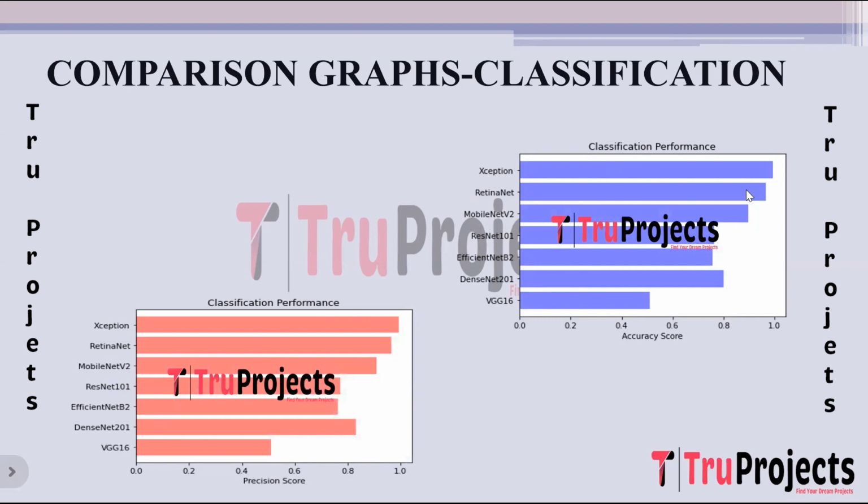This is the accuracy comparison graph. On the x-axis, we have accuracy score, and on the y-axis, we have algorithm name. Accuracy is a measure of the overall correctness of a classification model. It calculates the ratio of correctly predicted instances, both true positives and true negatives, to the total number of instances.